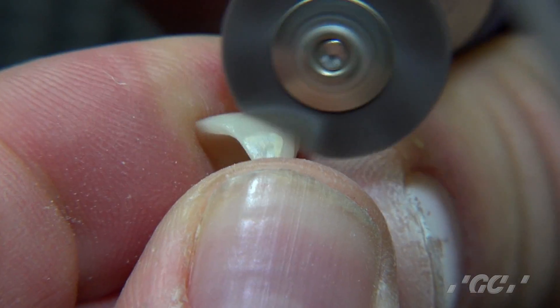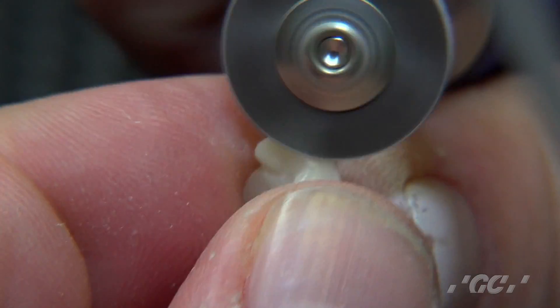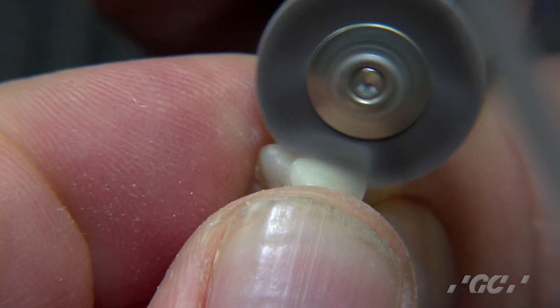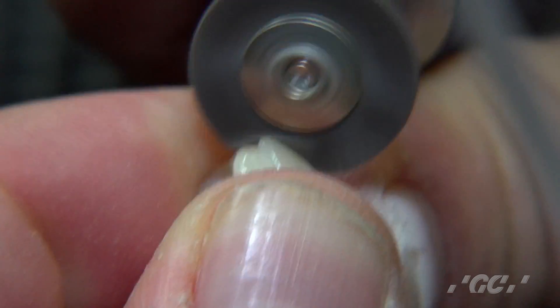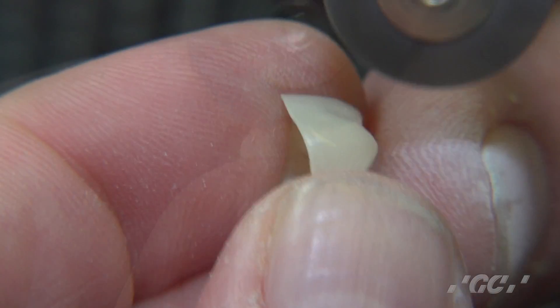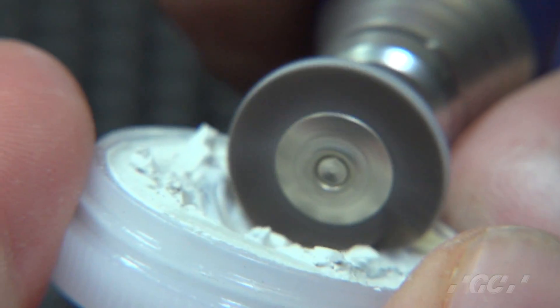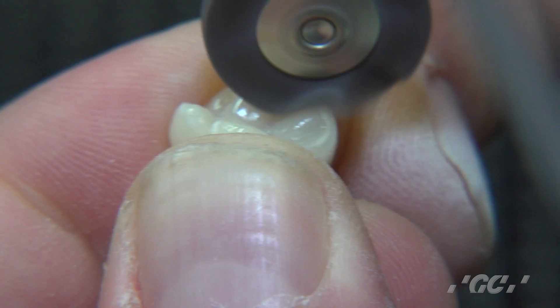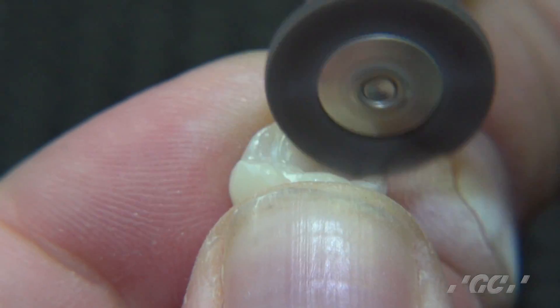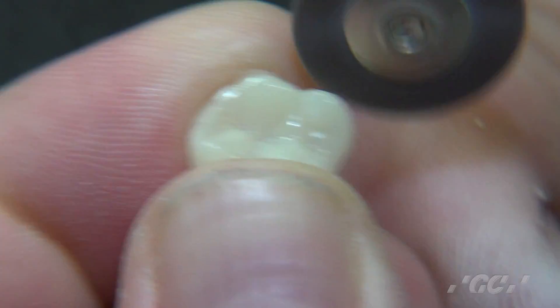We basically work this all over the crown. If you want more paste, you can apply more paste. Gently working it around the surface of the crown, the distal, the mesial. You can see how nicely and quickly that polishes up. Now we're going to add just a little bit more of the paste and work the occlusal surface. We gently work the polish into the occlusal surface, and it's really as easy as that.